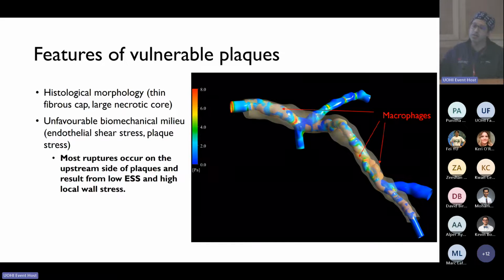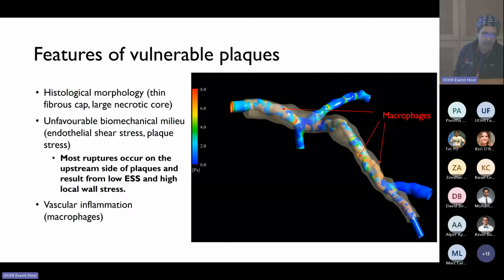And then what you can do with studies like this is actually at 2 time points, see how those factors relate to plaque progression. And this is entirely a research tool at present, but actually there are a couple of companies working to bring this into clinical frontline use and literally at the bedside with an angiogram be able to delineate things like this, because it may allow you to pick up points where the plaques may be more vulnerable. And that may be coming in the next 2 to 3 years to the coronary cath lab.